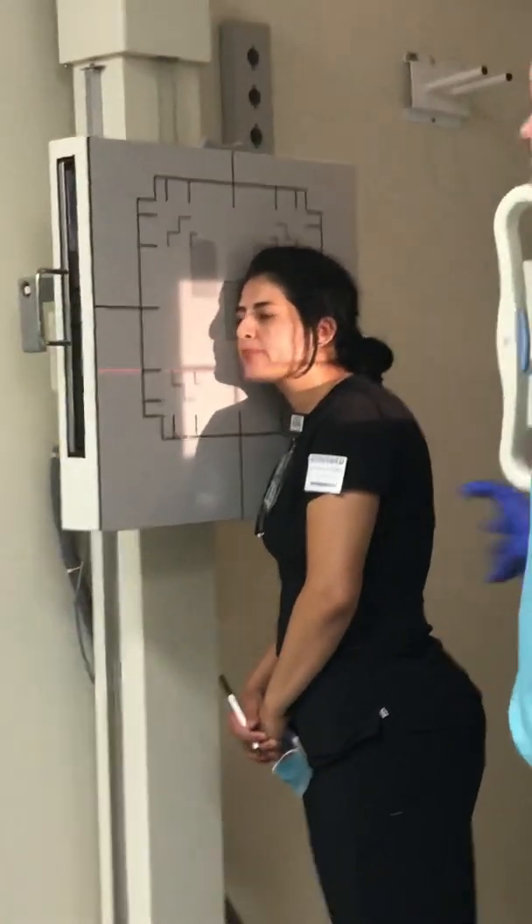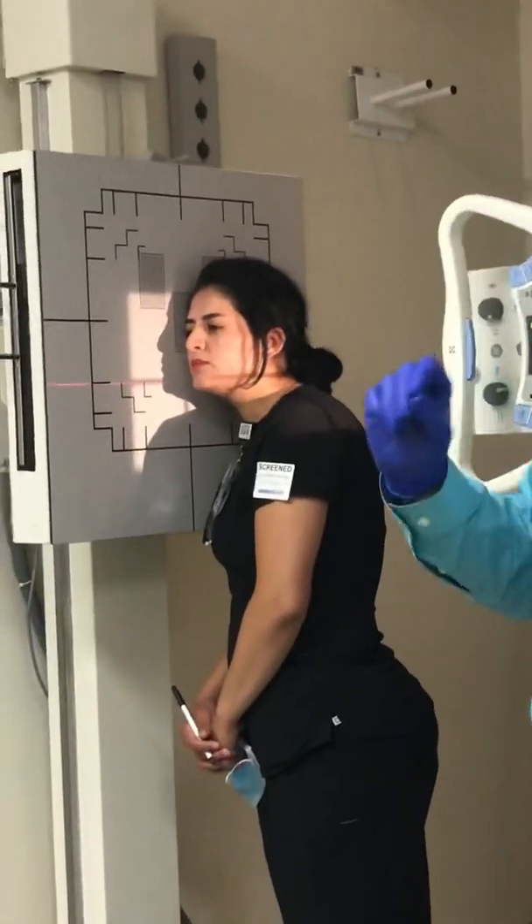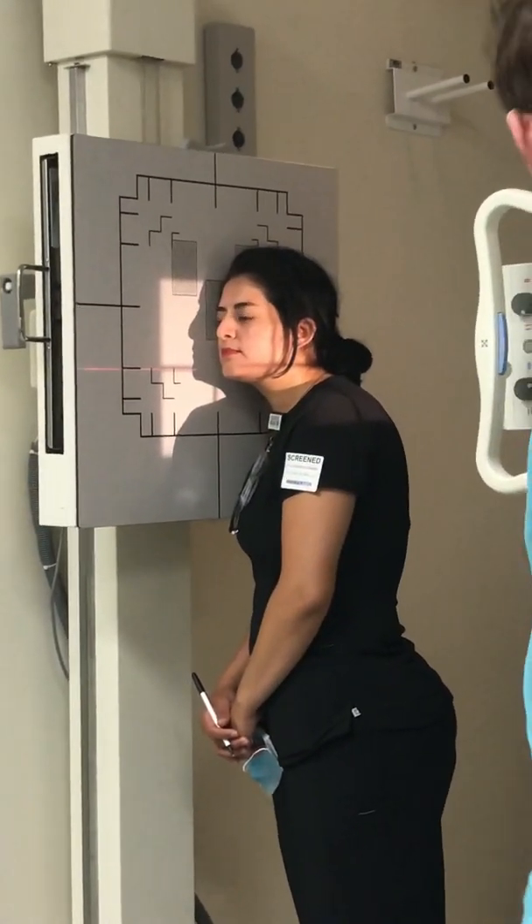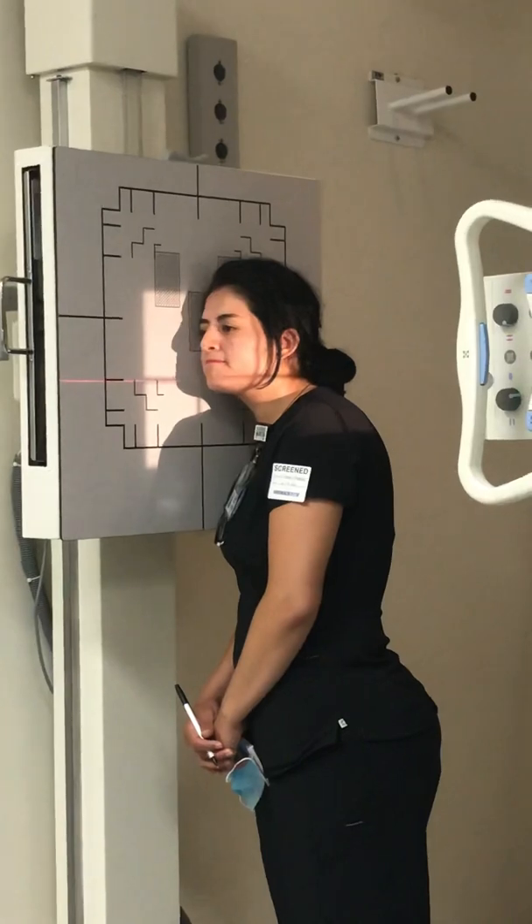I'm going to put my centering approximately at the gonion, but I'm going to adjust this as I fix the head and rotate her head. Since I'm not putting an angle on my tube, how can I achieve an oblique mandible?